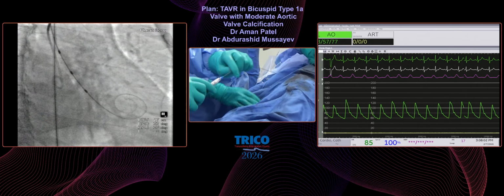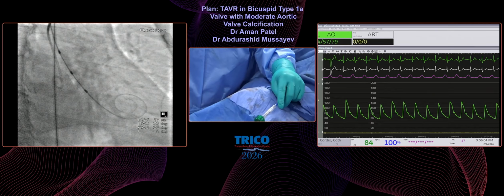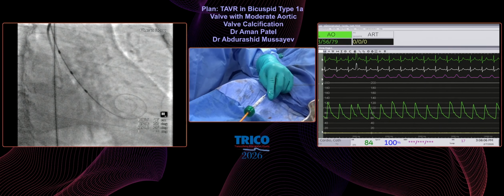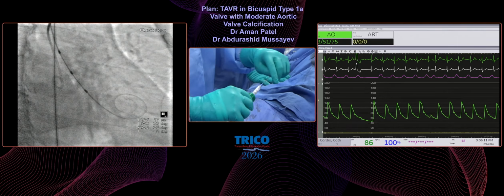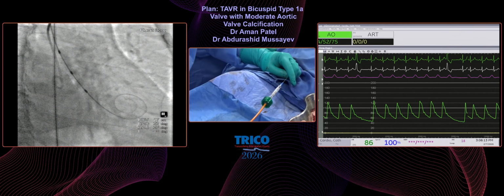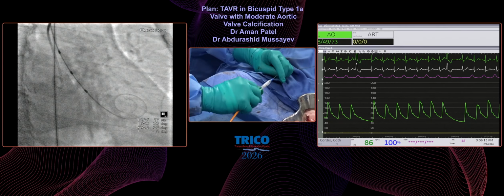I know you have a little bit more choices in the Medtronic valve. Here we're also going to use extra volume. Okay. Fine. So 1 cc extra will be around maybe 8.5% oversized, 2 cc. Add 1 cc more.